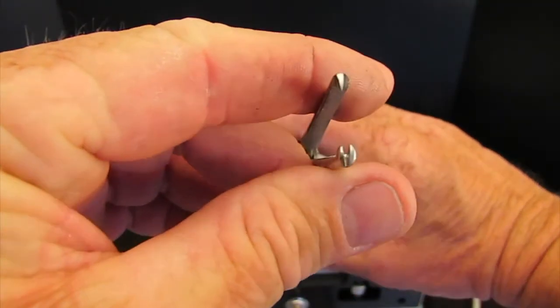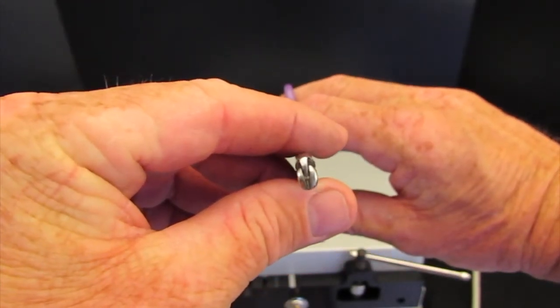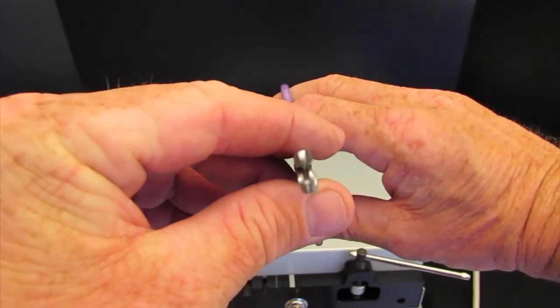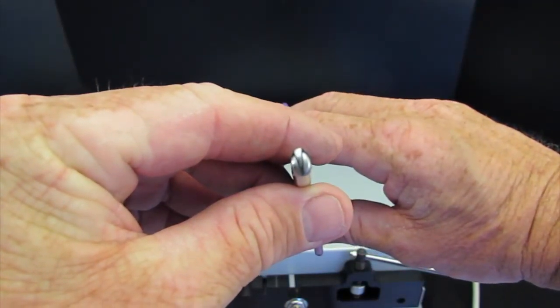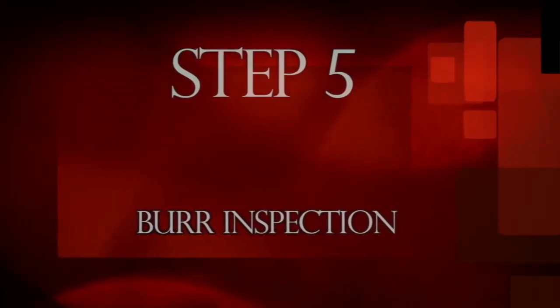On forceps with teeth on the tip of the instrument, slowly close the teeth and observe how they mesh together. The teeth should come together without the sides of the teeth touching until completely closed. Step five: burr inspection.